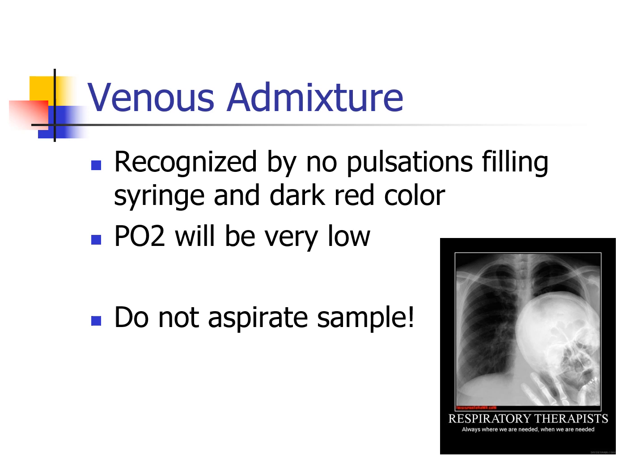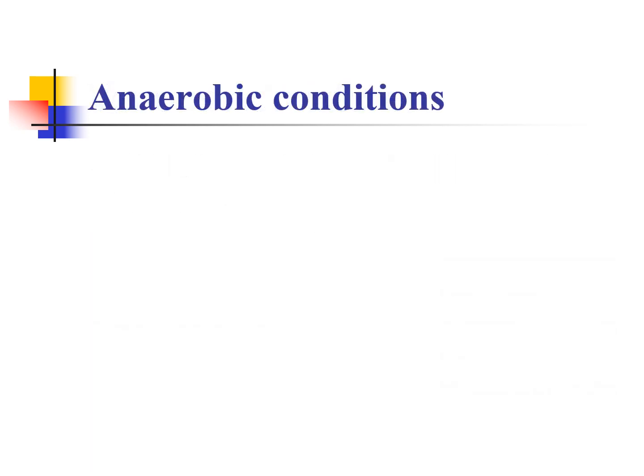The other thing to look at to know if you have a venous stick, if you're unsure of it for some reason or another and you run it, check what their saturation is, right? Especially if you use my pulse ox version of the modified Allen's test. What was their saturation at the time of the blood gas? If their non-invasive saturation, let's say, was 95%, and you draw a blood gas, and it shows their SaO2 at 85%, then you know you probably got a venous gas because of the big saturation difference there. Normally it should be within maybe 3 of the pulse ox if you have good perfusion on that patient. So that's one way of also knowing if it's a venous versus an arterial gas.